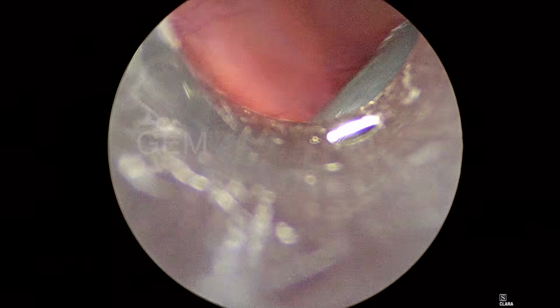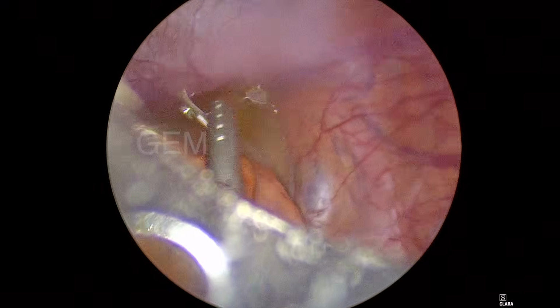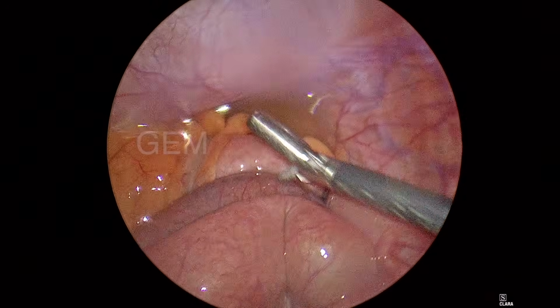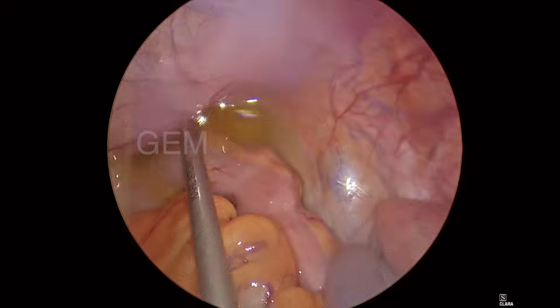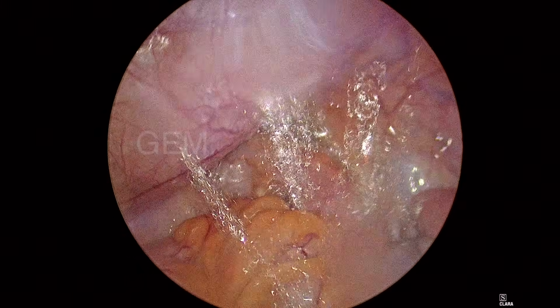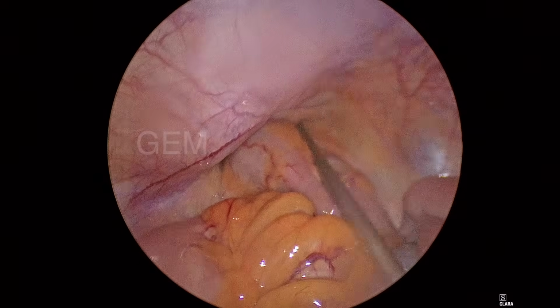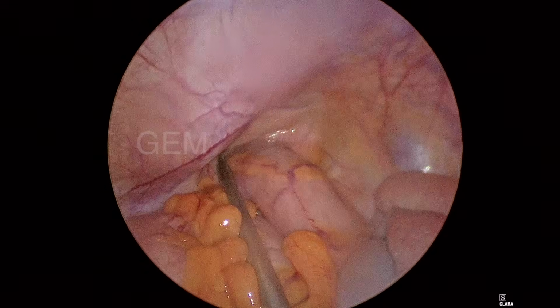So I am going to the suprapubic, pelvis, and from the suprapubic port you can see we can show the pelvis very well. The suction is from the umbilical port. The sigmoid colon or rectum is retracted from the right iliac port. This is the view from the suprapubic port to the pouch of Douglas and pelvis.